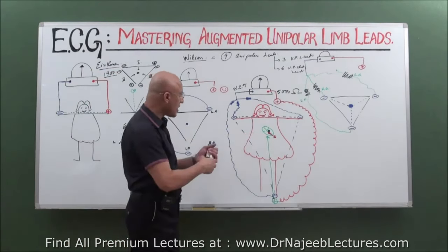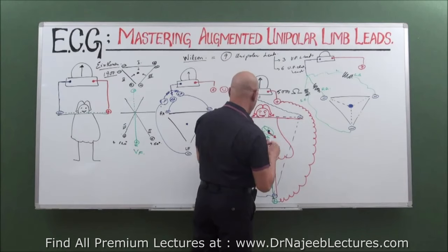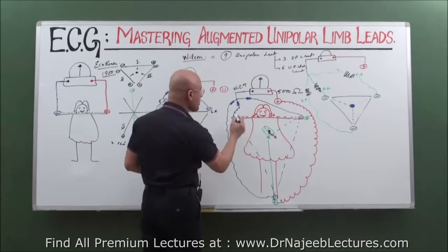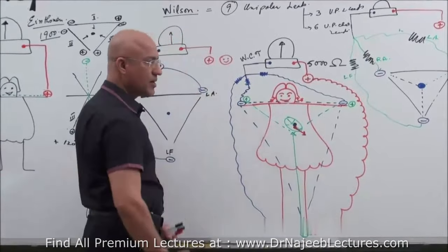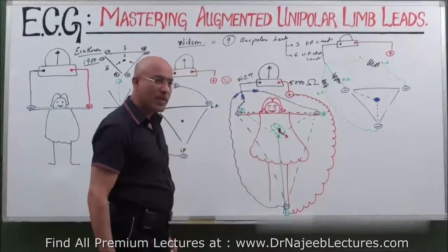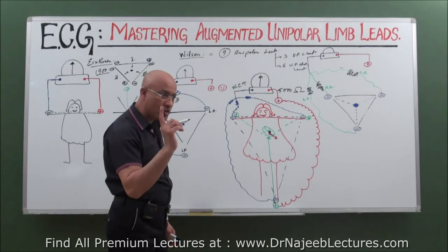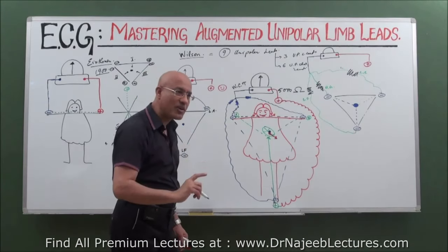Is that right? When he put this positive electrode on this side, what will he achieve? Another lead. If he moves the positive over here, he will achieve another lead. In this way, he was able to make how many new leads? Three leads. And these are considered unipolar leads, because the definition of a unipolar lead is that the positive or exploring electrode is measuring the potential in reference to the indifferent electrode.